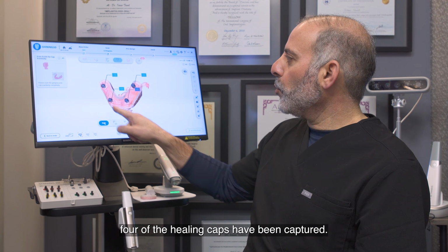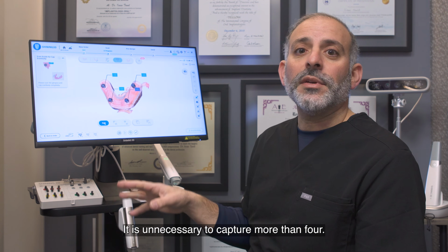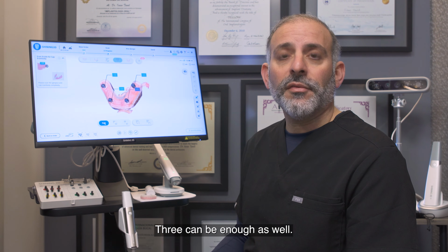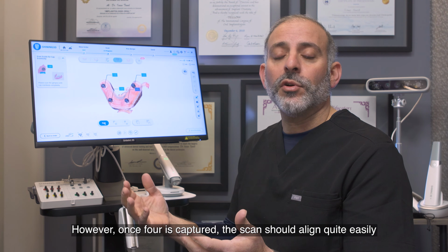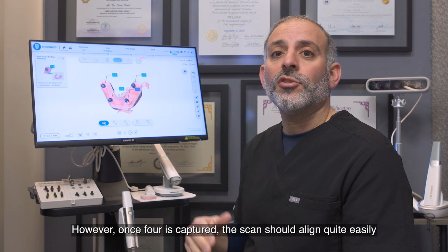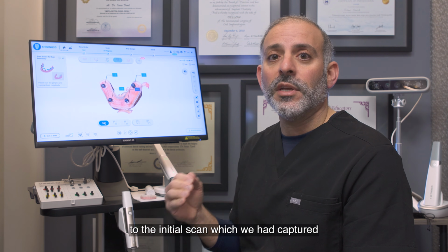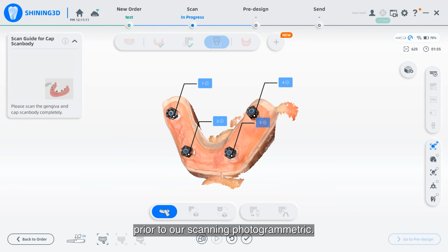You'll notice all 4 healing caps have been captured. It is unnecessary to capture more than 4. 3 can be enough as well. The more the better. However, once 4 is captured, the scan should align quite easily to the initial scan which we had captured prior towards scanning photogrammetric.